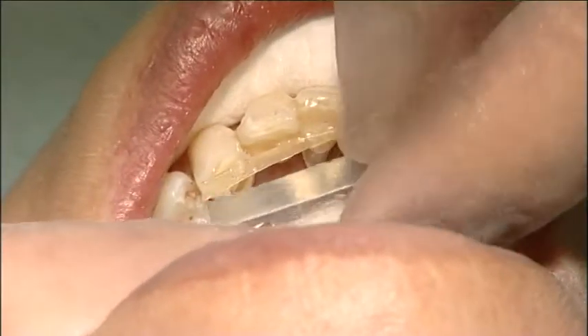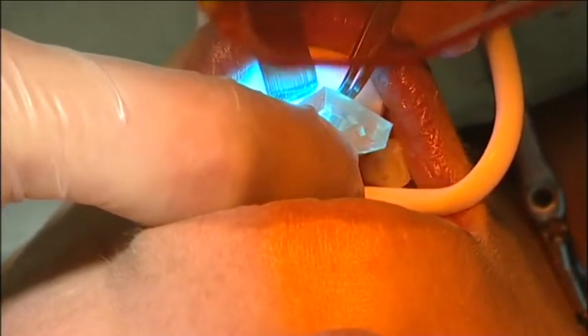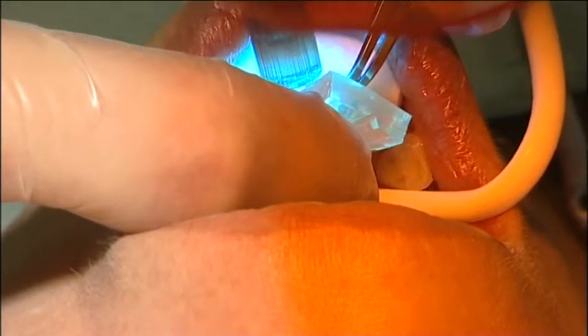The fibre was adapted with a silicon instrument and initially light cured for 5 to 10 seconds on each tooth. The fibre should be positioned as incisely as possible.